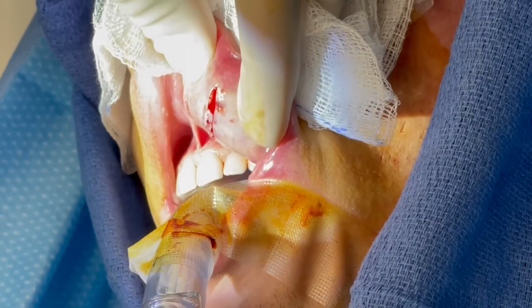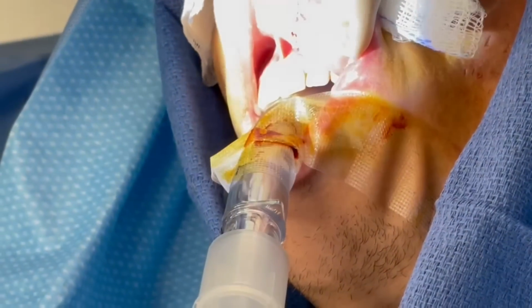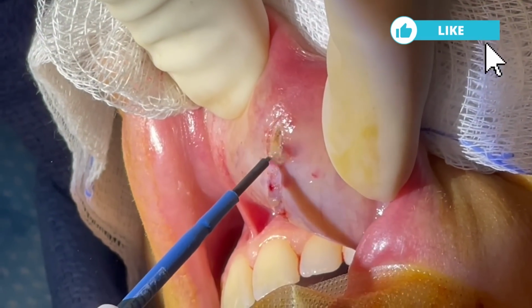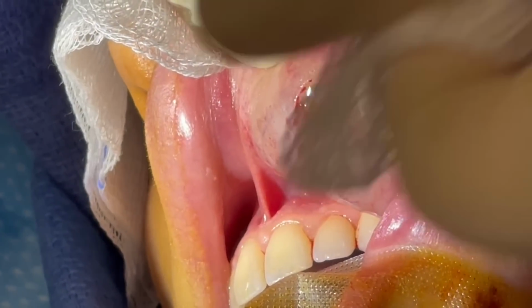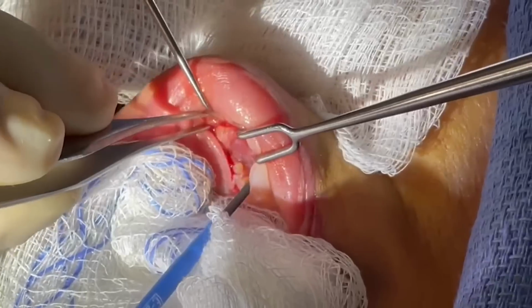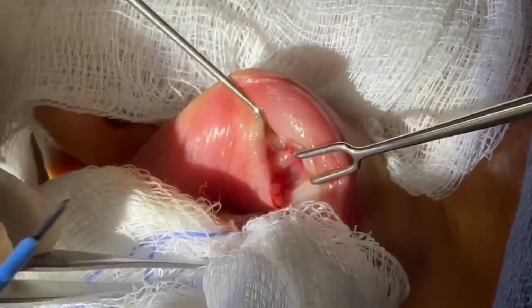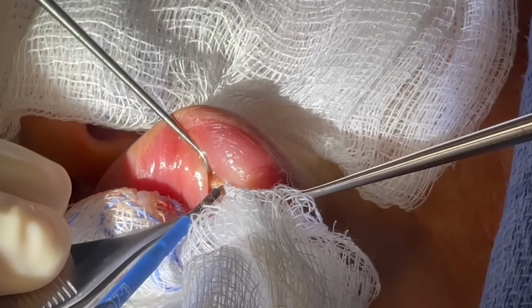Dab, please. Bovie, please. Dab, please. Aha, this is coming out already. Interesting. Okay. Dab again, please. Perfect. It is a sebaceous cyst. On the lip? No, yes, it comes on the lip skin.